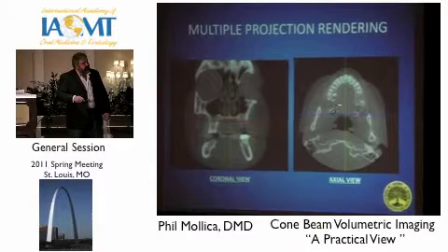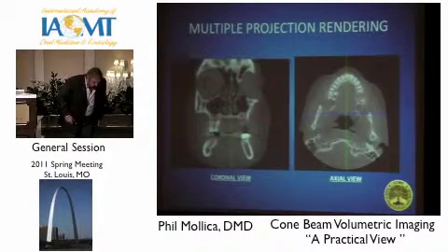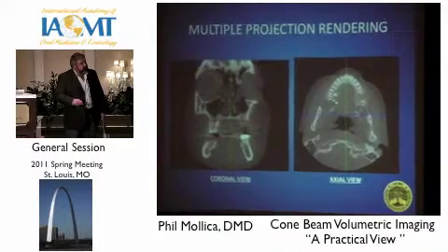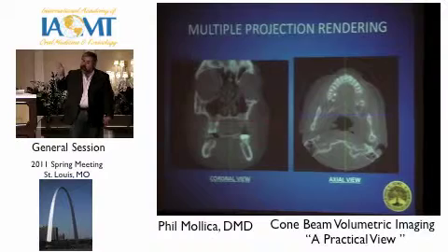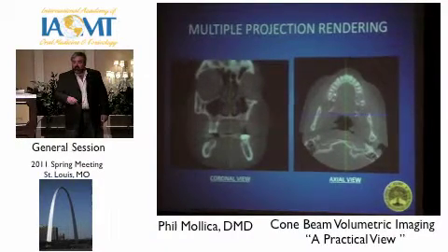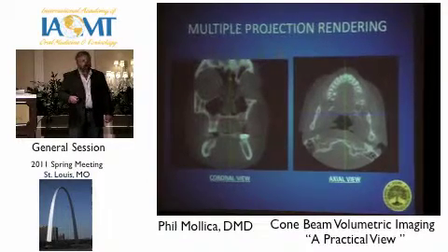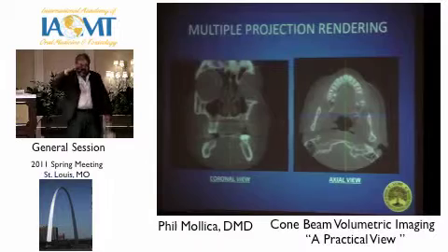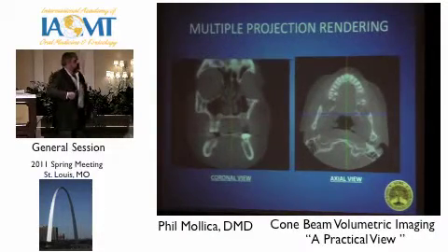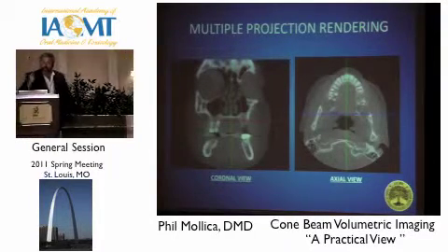I mean, in this particular case, we're looking at root tips. We're looking down into somebody's root tips. How cool is that? A lot of times, like on these maxillary teeth, we look at the typical PA, we come down, and all of a sudden there's a big black hole in between these roots. Wow, the infection was in there, but it was blocked out by the buccal plate. How cool is that? So we can go up and down, forward or back, and we can rotate around. Get multiple projection views with this one simple shot.